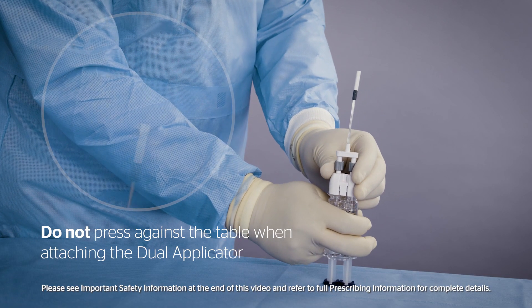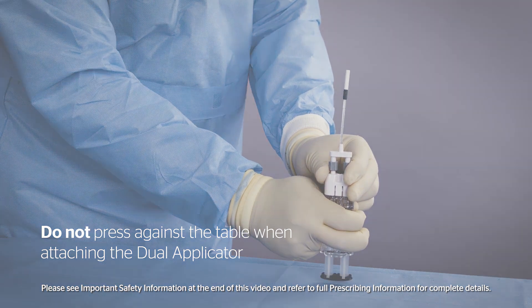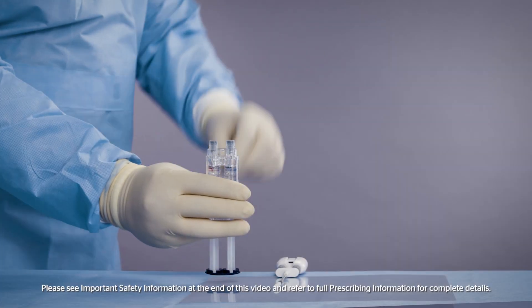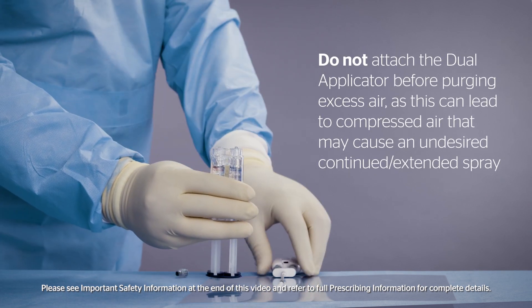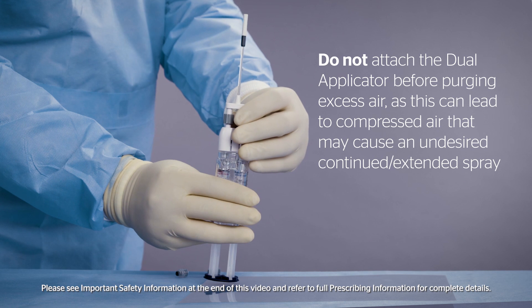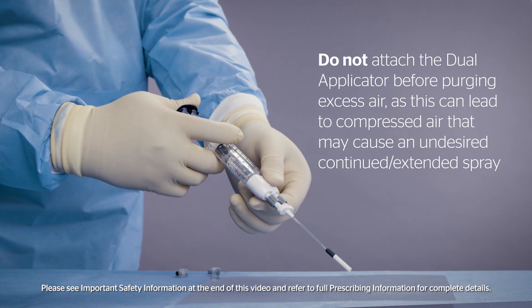Do not press the plunger against the table when attaching the dual applicator. Do not attach the dual applicator before purging excess air, as this can lead to compressed air that may cause an undesired continued or extended spray.